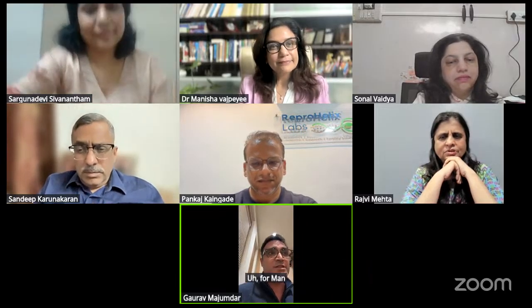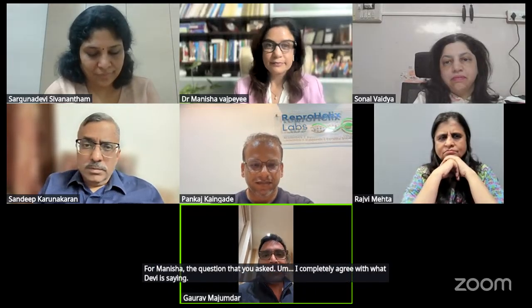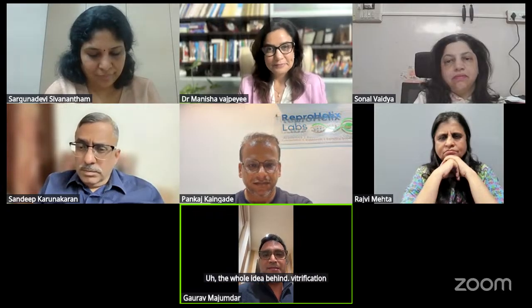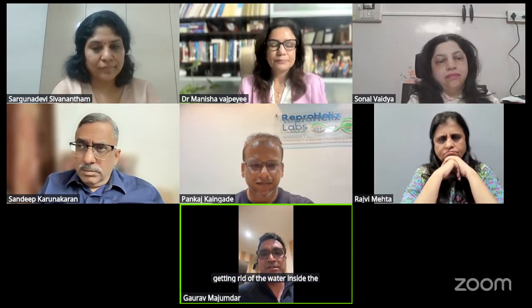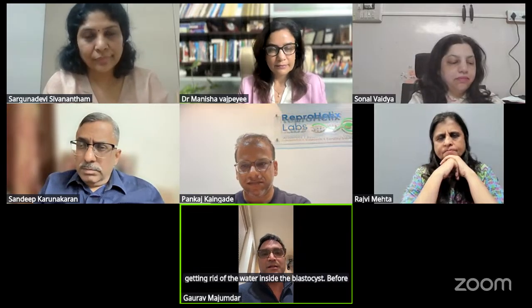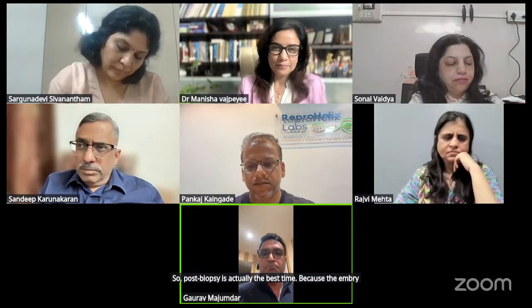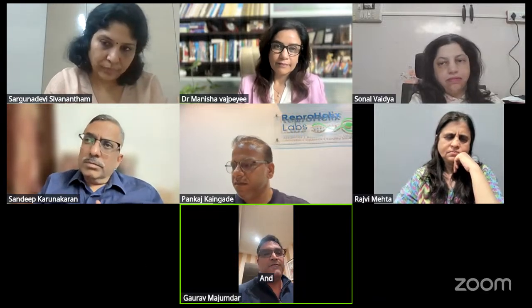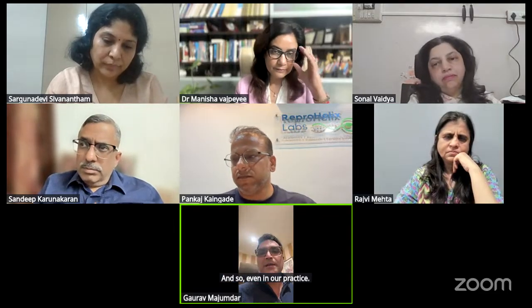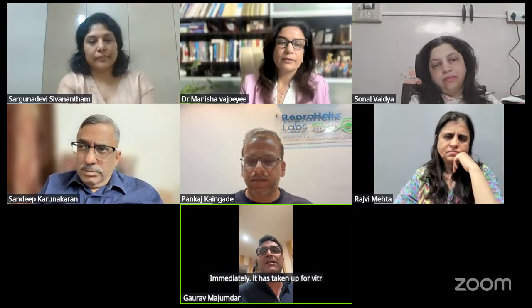For Manisha, the question that you asked, I completely agree with what Devi is saying. The whole idea behind successful vitrification is to first get rid of the water inside the blastocyst before we vitrify it. So post biopsy is actually the best time because the embryo is completely collapsed, completely devoid of the blastocele fluid. So even in our practice, the moment the biopsy is over, immediately it is taken up for vitrification. Not a second is wasted.